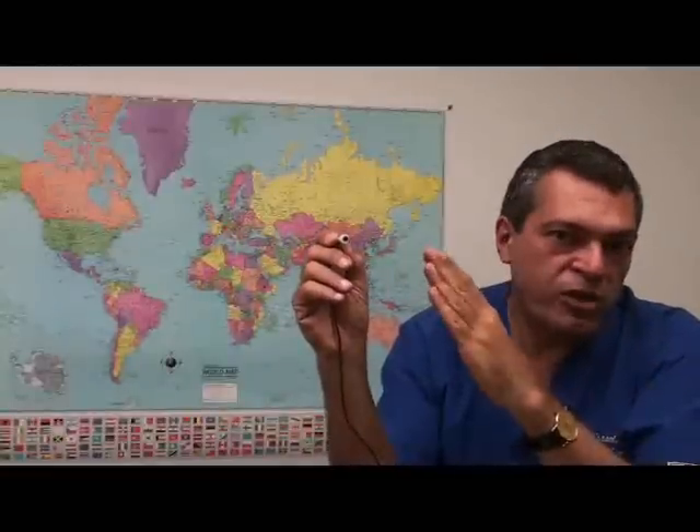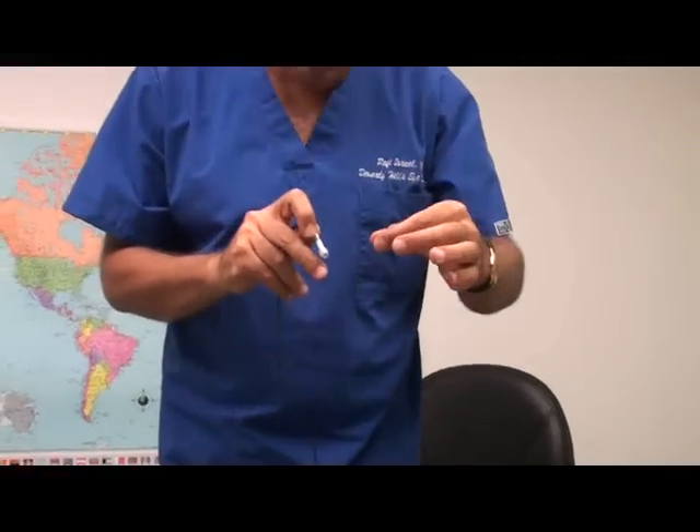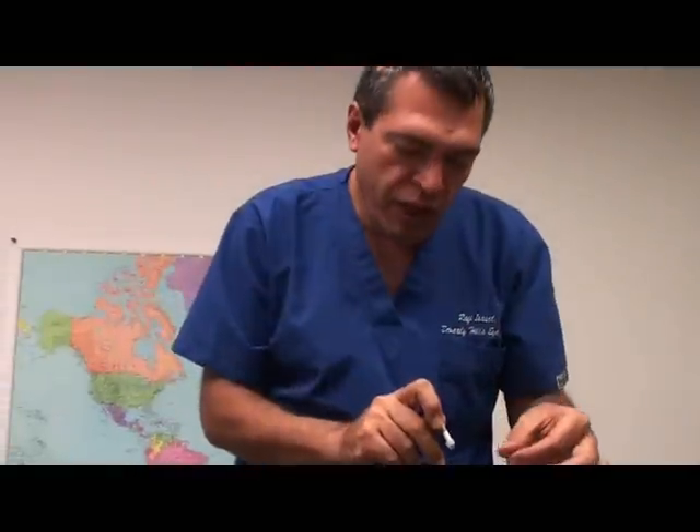At the beginning, I recommend reclining the patient about 10 to 15 degrees so you can be on top and perpendicular to the eye as you approach. After trying this a few times, the learning curve is not that high — probably after five or six eyes, you'll be able to scan the left eye just as easily while sitting on the right as you do the right eye.